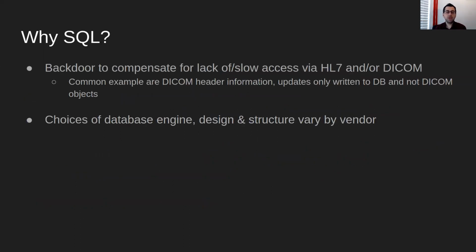So what is the advantage of using SQL for accessing the data? A lot of times, you're able to get at your data through the front door APIs, so to speak, something like HL7 or DICOM. However, sometimes these APIs are not ideal for getting information. For example, if you wanted to find a cohort of patients, trying to do that through an HL7 version 2 feed is akin to suicide, because now you've got to listen to every single message flying in, and the variety of messages and variety of machines is just not very realistic.